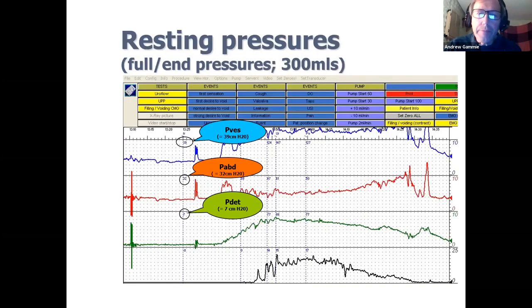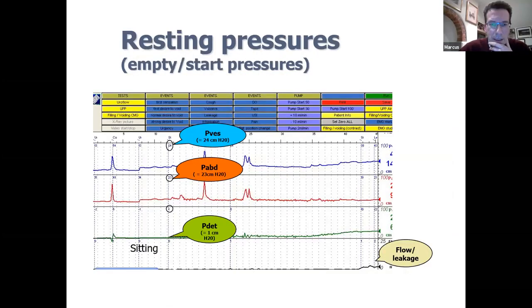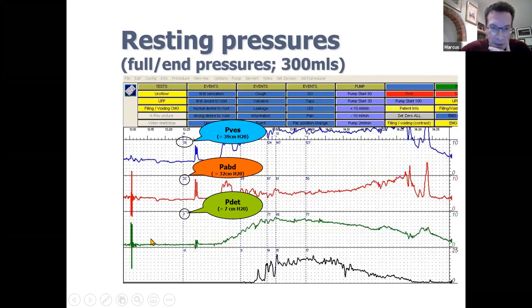Okay, so we're talking about the compliance of this trace. Here you've got a detrusor resting pressure of 1. Here you've got detrusor overactivity. This has settled by the time you come towards the end of the trace. You've done an entire load of filling, which isn't displayed on this trace. So when you come to the end of the trace, I would describe this as looking flat. It's not overactive, and so this is actually a pretty unremarkable resting detrusor pressure at this stage.